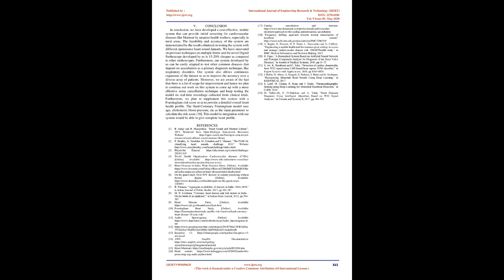After pre-processing, segmentation, and spectrogram conversion, a training set containing 11,274 images and a validation set containing 600 images, 300 normal and 300 murmur, was created. After 5 epochs we got a validation accuracy of 79.83%.